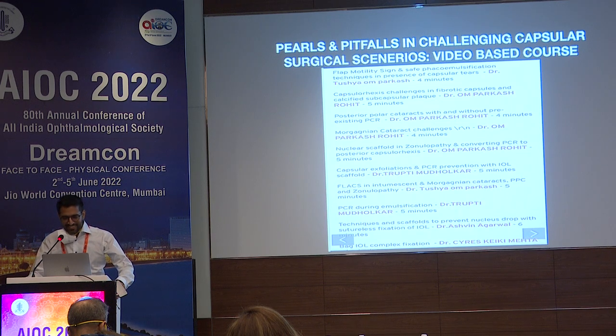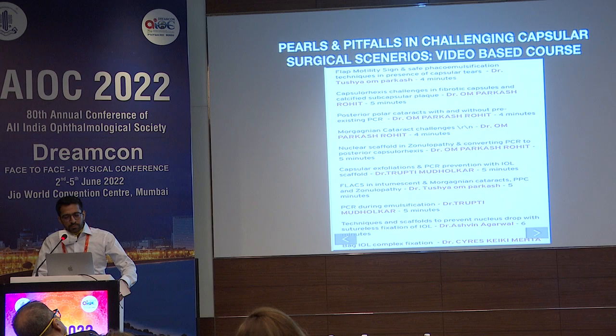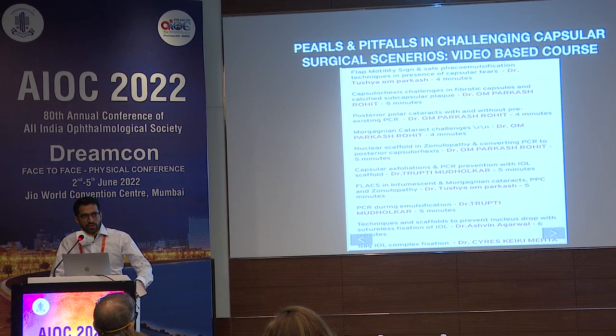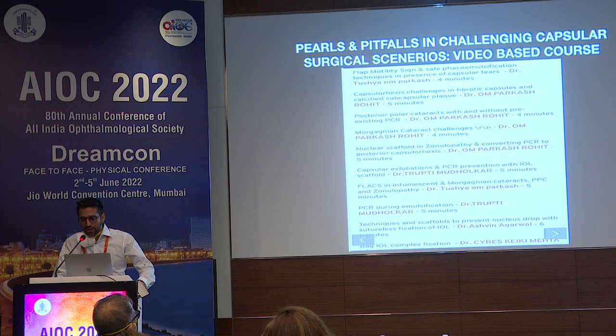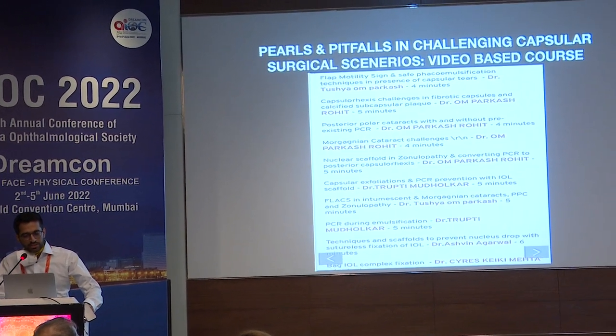Everybody. Today we'll be showing you a video-based course on pearls and pitfalls in challenging capsular surgical scenarios. We have a very good faculty today, so I'll be covering anterior capsular tears and flap motility sign and safe phacoemulsification techniques in presence of capsular tear.